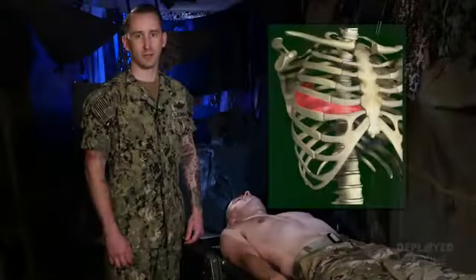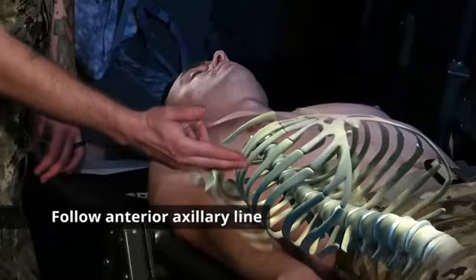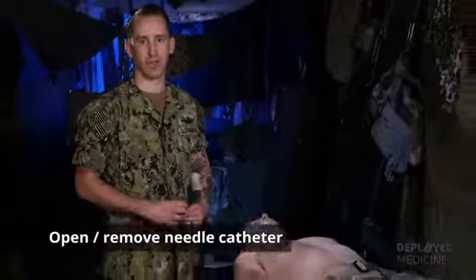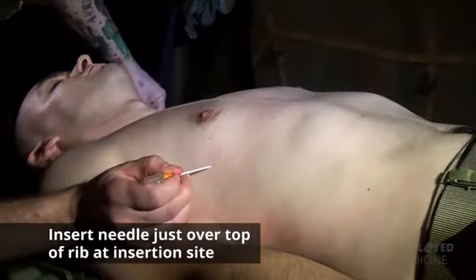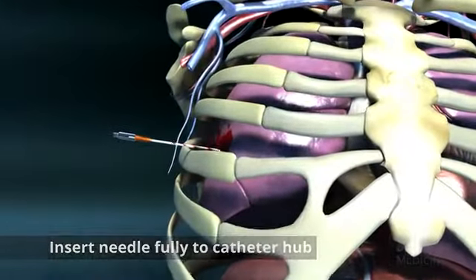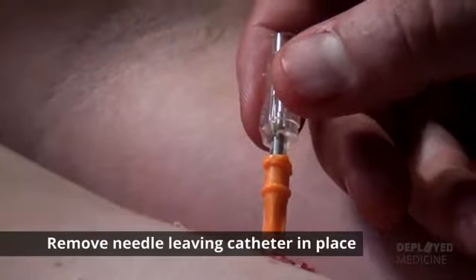The lateral site is located in the 5th intercostal space, anterior axillary line. To locate it, you're going to follow the patient's anterior axillary line to just lateral and below the nipple. Once you've identified the site, take your 10 or 14 gauge 3¼ inch needle catheter and begin your insertion. Following the anterior axillary line, I'm going to insert my needle just over the top of the lower rib at the insertion site. Insert the needle catheter unit all the way to the hub and hold it in place for 5 to 10 seconds to allow decompression to occur. After the NDC has been performed, then remove the needle, leaving the catheter in place.